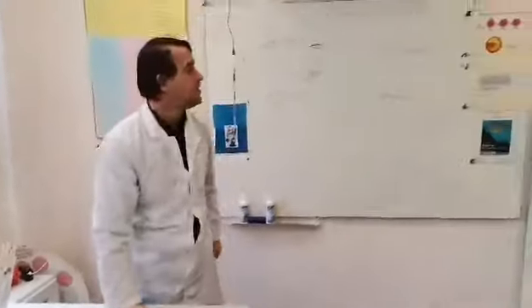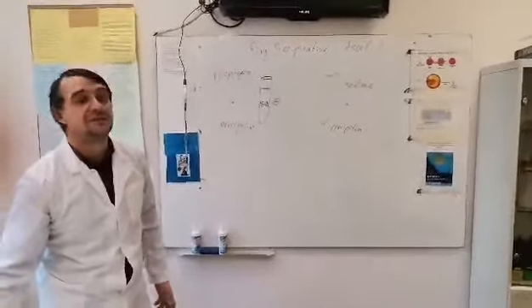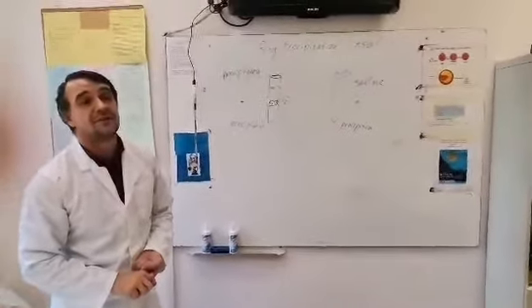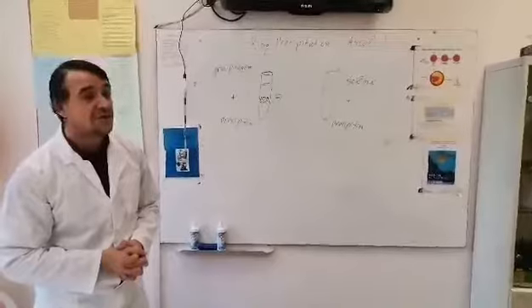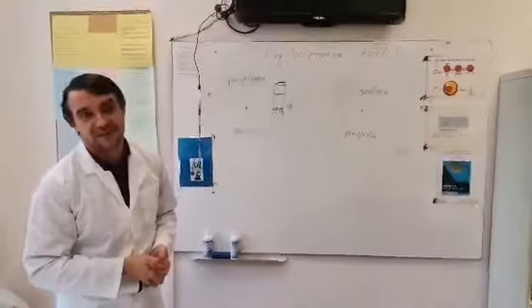Okay, let's compare these. You see the positive reaction and the negative control. Okay, so this reaction is not very much used in practice, as precipitation usually is not so specific. However, it was very much used in the past to detect some extremely dangerous diseases like anthrax, for example. Nowadays the reaction has been widely replaced by more specific and more precise methods.